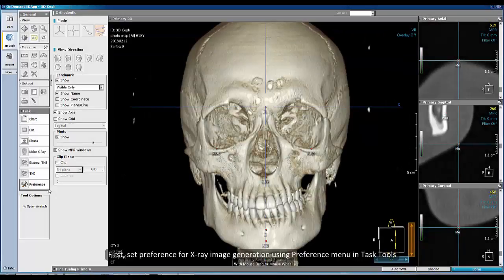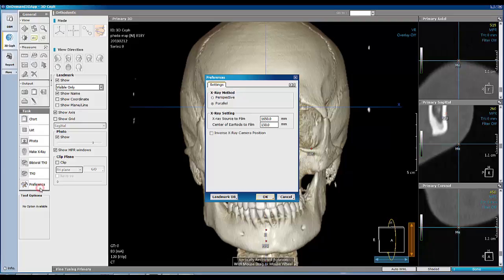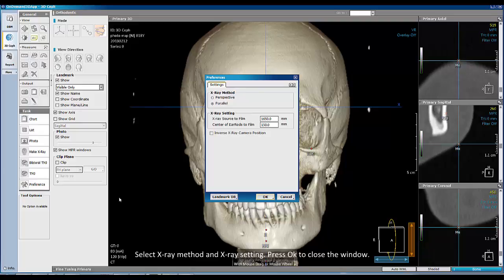First, set preference for x-ray image generation using the preference menu in task tools. Select x-ray method and x-ray setting, then press OK to close the window.